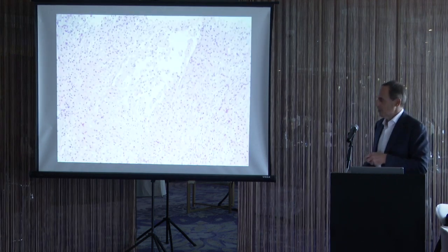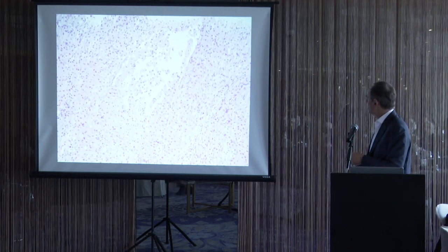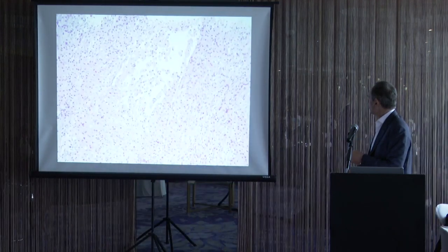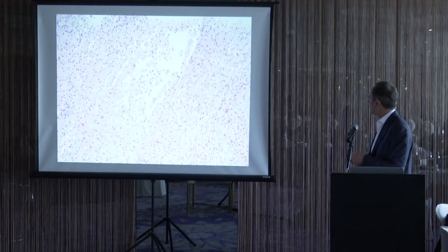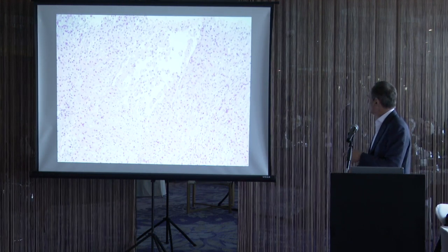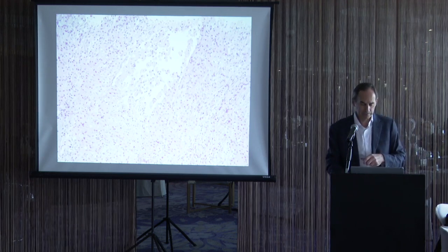Another clue to nonspecific granulomatous prostatitis is that they result from a ruptured gland. So you can see here there's this gland with an atrophic cytoplasm with these foamy histiocytes in the middle. And you can see that these epithelioid histiocytes are surrounding this ruptured gland, which you wouldn't see with prostate cancer.